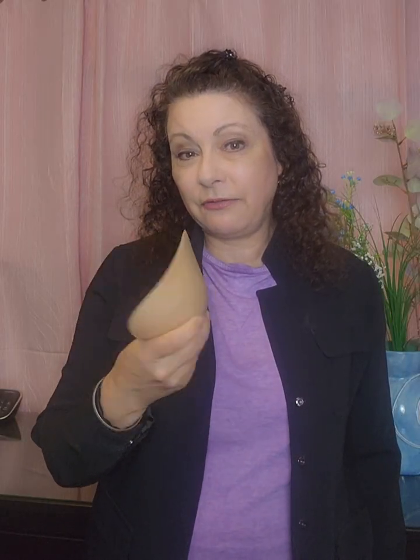So that is a full breast prosthesis. But what if you've had a lumpectomy or a partial and you don't need a full breast prosthesis? Well, then there's something called a partial, which is hollowed out on the inside, so it can go over the smaller breast and then make the girls into twins. At the end of the day, you should be able to wear your tightest, whitest t-shirt, and the girls look like twins. Nobody can tell. And these are both made out of surgical grade silicone.